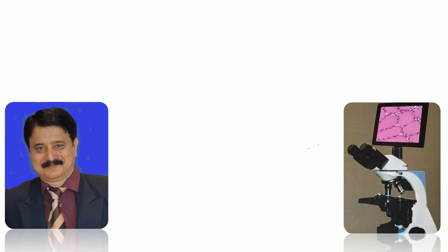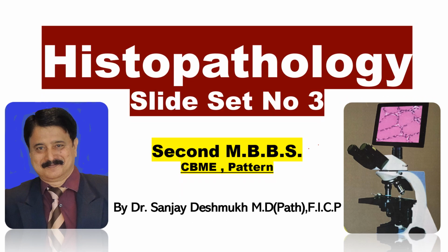I am presenting the histopathology set for second M.B.B.S students, and as you know it is useful for you for the slide spotters with OSPE stations and also useful to the table viva on the slides that you are supposed to draw and answer the viva.